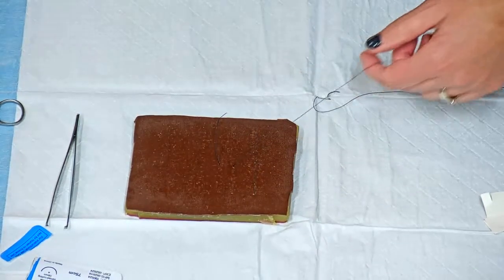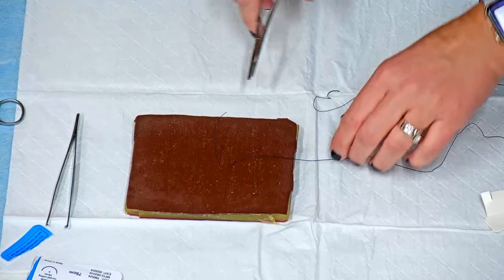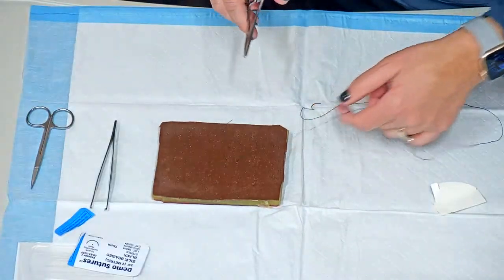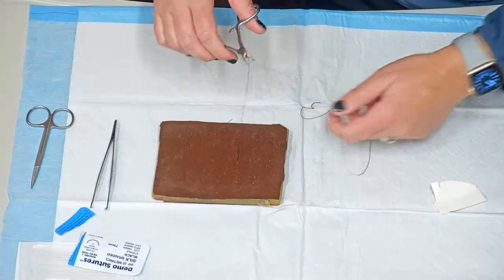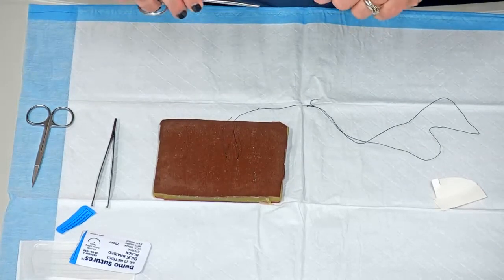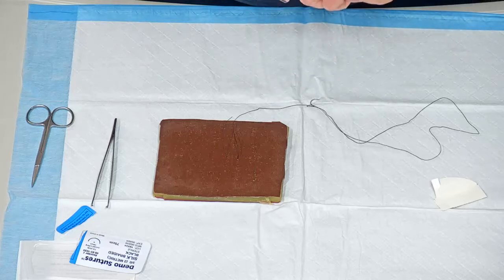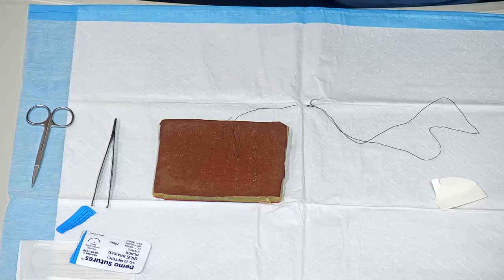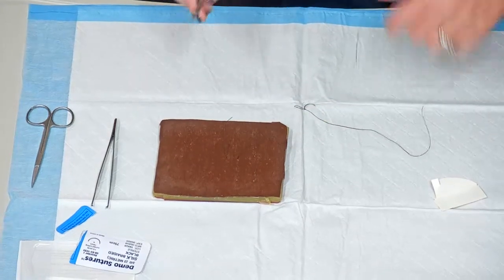So you're going to continue to use your hemostat, and the idea is that we will make a square knot. So the first knot, you gently go around once, twice. And I'm going to talk to you about this briefly before I do it. When we make a square knot, we always go away and then back towards us, away, back towards us. You can also start the opposite, but you want that alternating pattern. So get a pattern that you will stick with. I always go forward first.